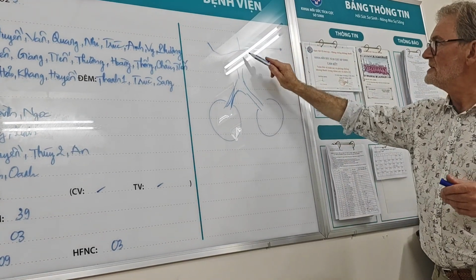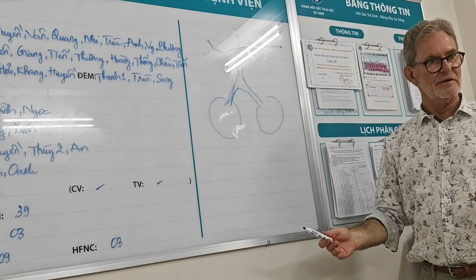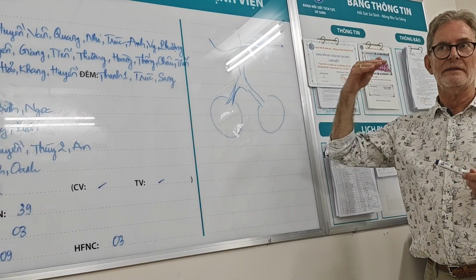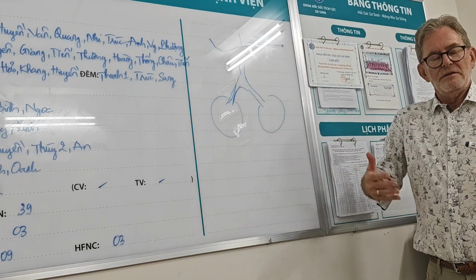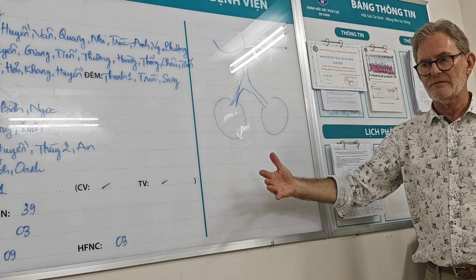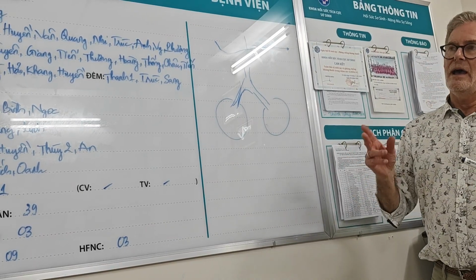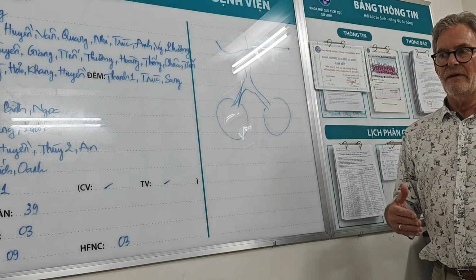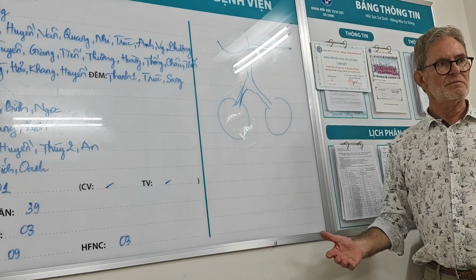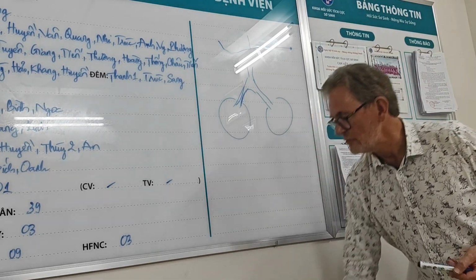It means this volume of gas is just sitting in the lungs, going nowhere. With the next breath, you get that amount of gas staying again, and you tend to get very overinflated. You look on your x-ray, and the baby looks really overinflated, and you think, if the baby's overinflated, the problem must be too much pressure. But it's not. It's because your ventilation is set up wrong.